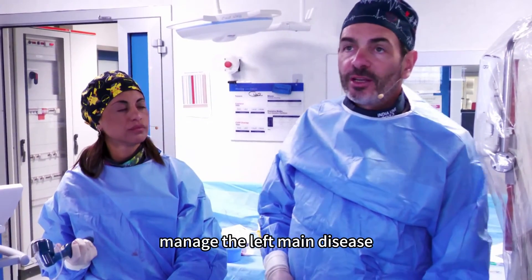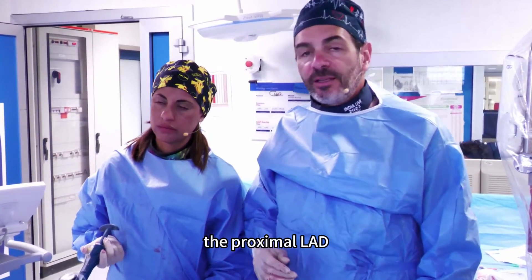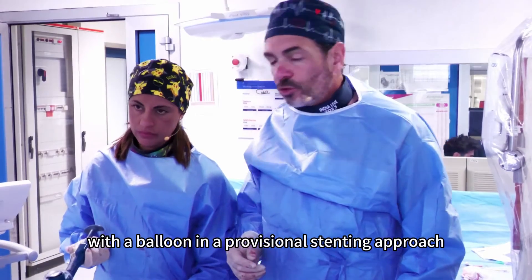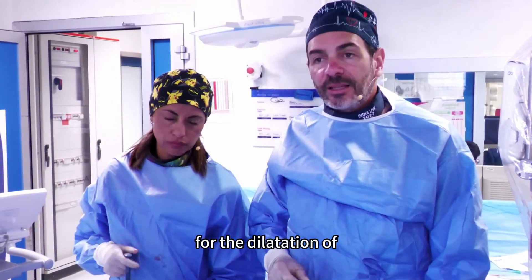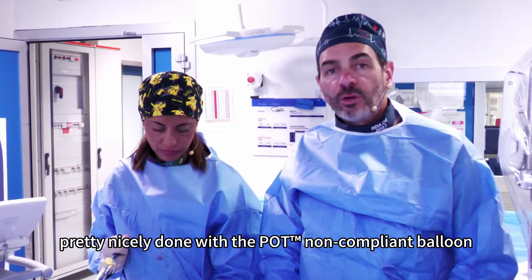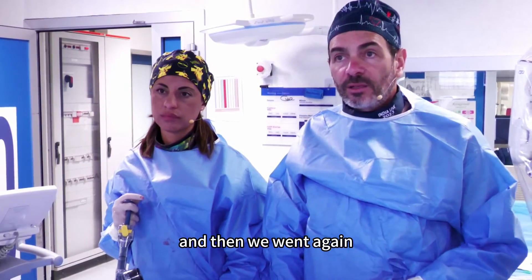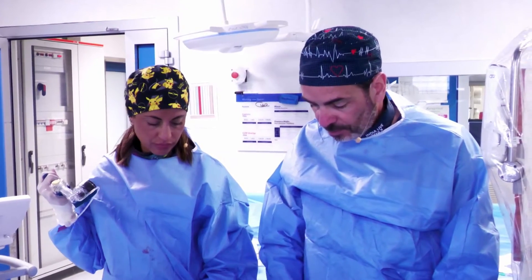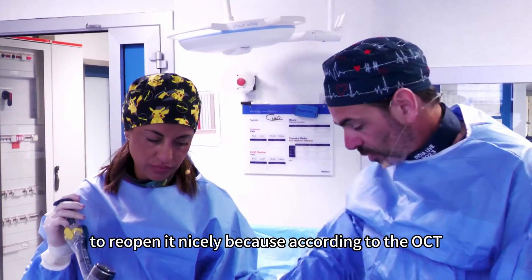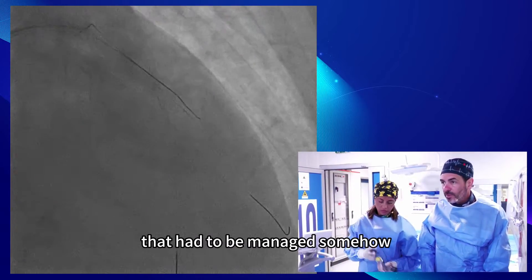Afterwards we managed the left main disease. We placed a stent, a 3.5 by 30, from the ostium of the left main to the proximal LAD. Then we did a kissing balloon with the circumflex, which was opened with a balloon in a provisional stenting approach. We then used a POT non-compliant balloon for dilatation of the proximal part of the stent in the left main — done nicely with small shoulders, avoiding going into the proximal LAD.